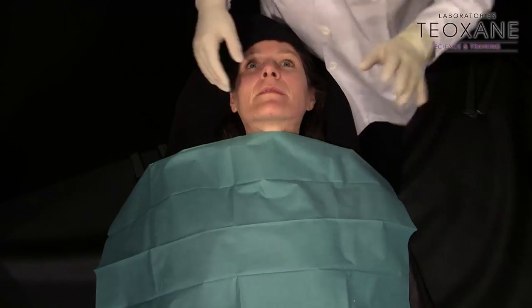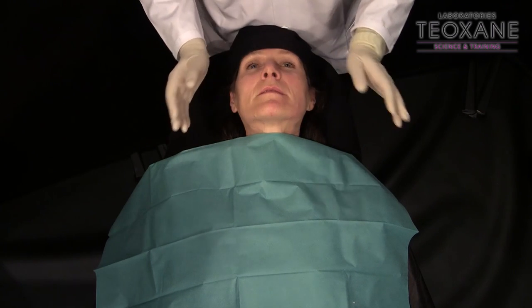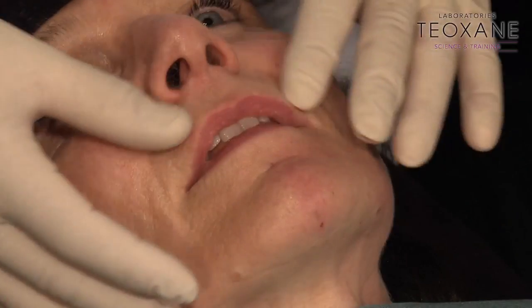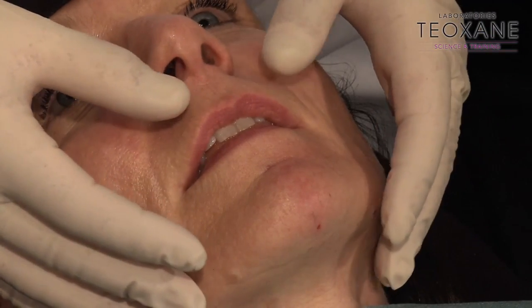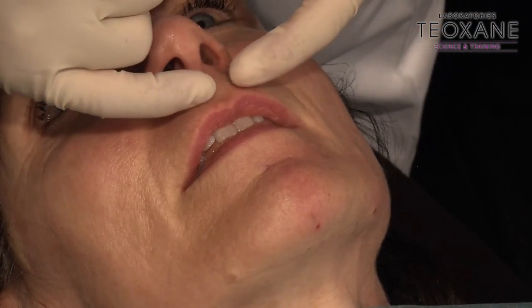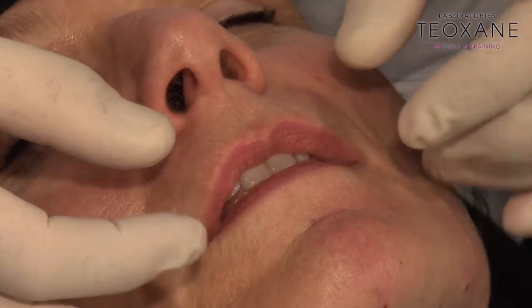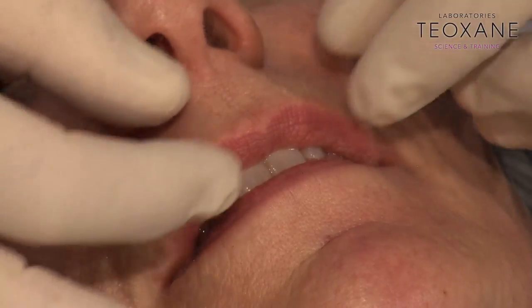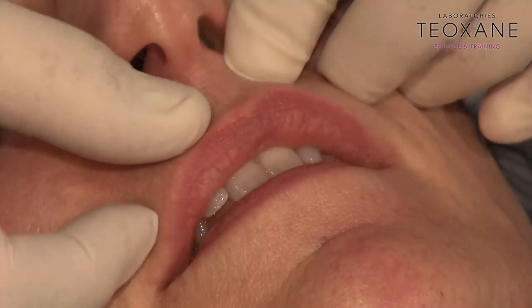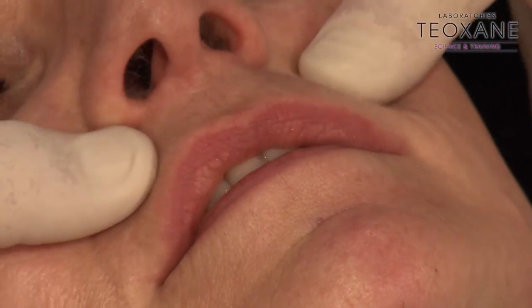Alors, RHA 2, the new one, I tried it like a couple of months ago. I honestly love it. It's so fluid, flexible. It has a great plasticity, and I think it's the perfect product for the lips. There are two ways. She has difficult lips because if you just highlight the outline, you may increase the problem of the lips which are turning in like this. So if you just highlight the outline, it might be worse. So you need to have more juiciness, more redness, more red. So there are two different techniques to do that. I'm going to show you.